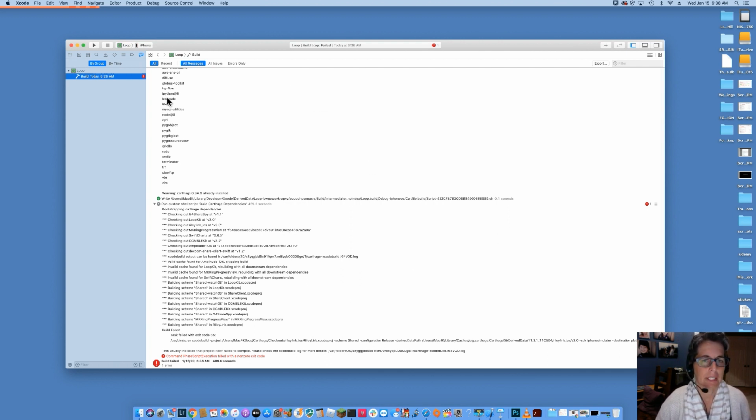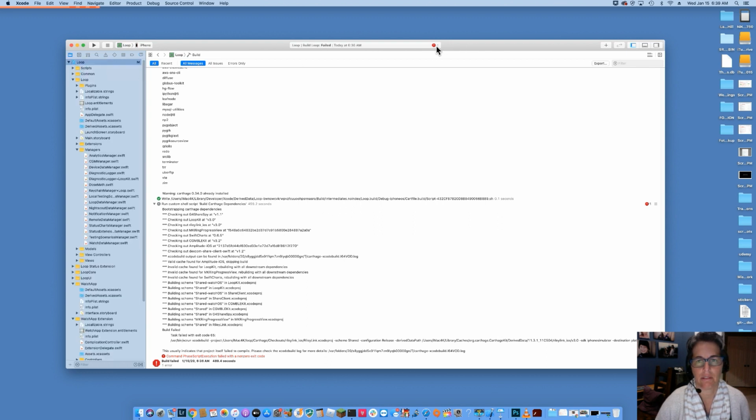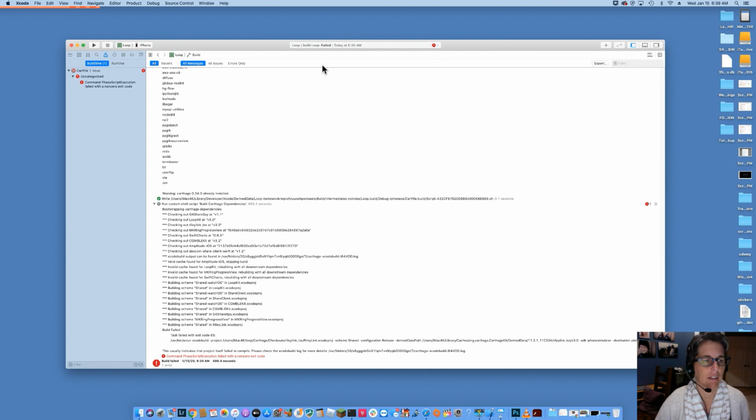So basically what popped up is it said I had a build error, and if I click on that little red notification, it says it's a command phase script execution, blah, blah, blah. So the first thing that I do is, I actually go to this little icon here. If you hover over it, it says it's the report navigator. And I find the topmost line in this column.